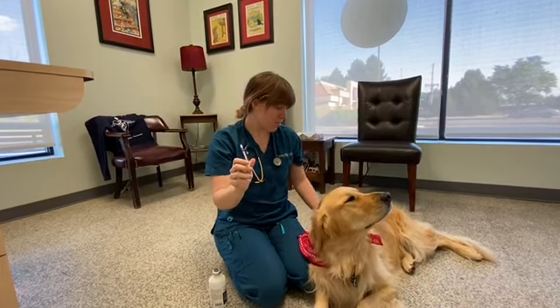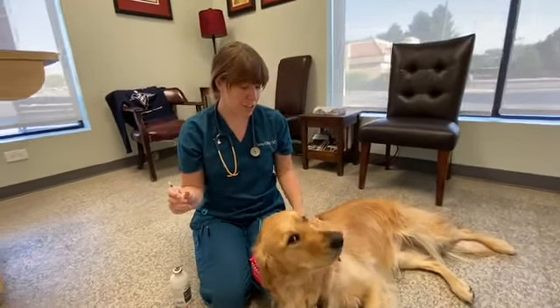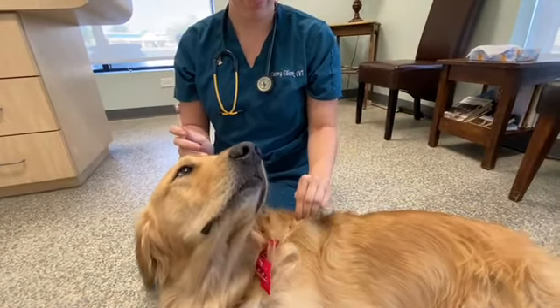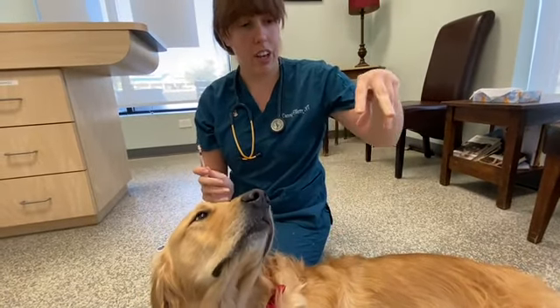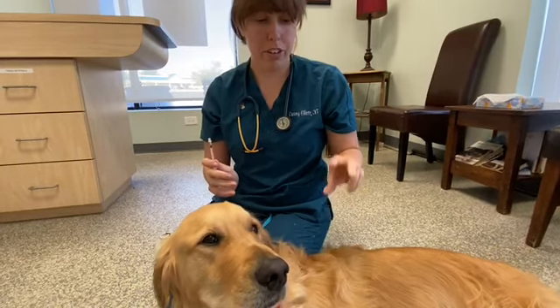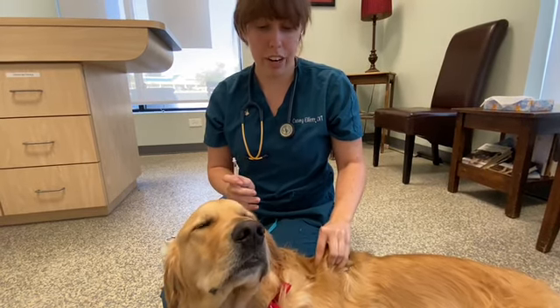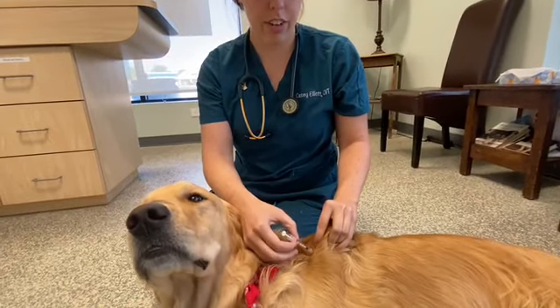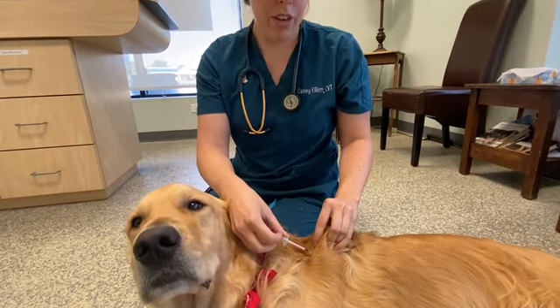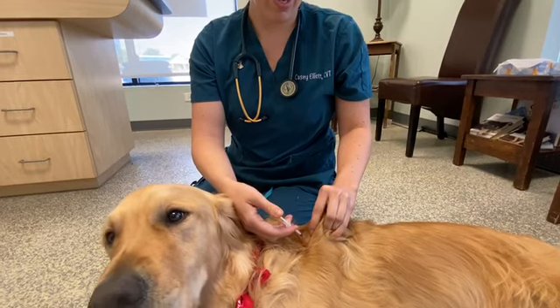Then you want to go under the skin. You find an area between the shoulders where they have lots of scruff, lots of skin, and you just kind of pick it up — kind of like if you were to pick up a napkin or a tissue. If you pick it up with your fingers like this, it creates a little tent. Position your pointer finger on the door of the tent. You definitely want to lift the skin up away from the body so you know you're getting under there. Take your little needle and go right into the door of the tent. Then we always pull back on our insulin syringes to make sure you're not getting any blood in the syringe.